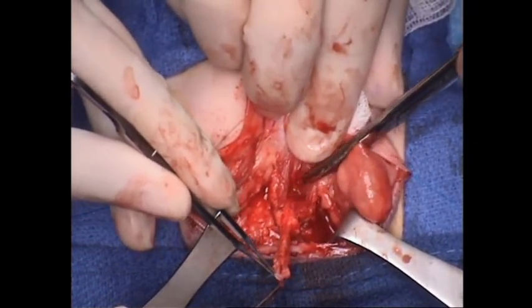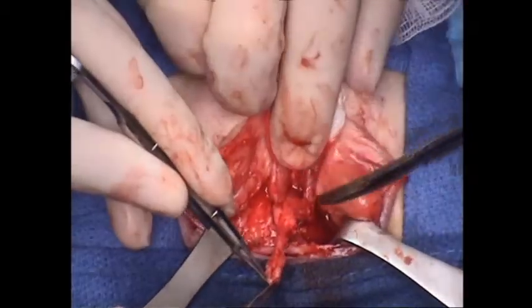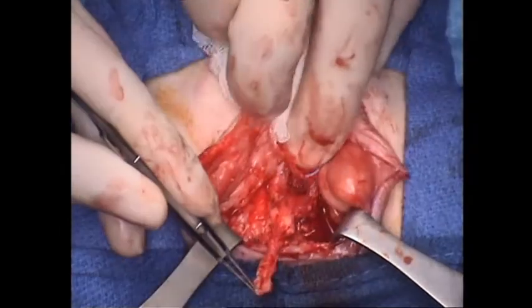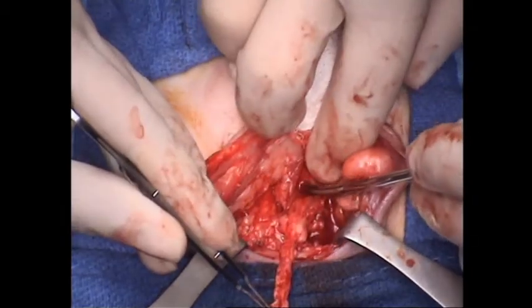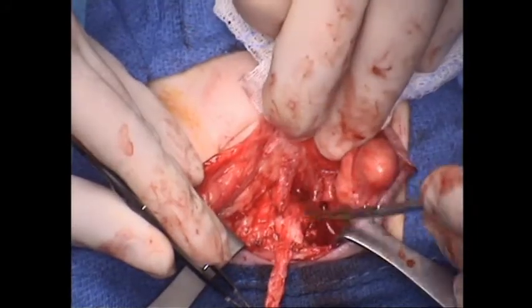And so we stop this dissection where the corpora are diverging, but once you start doing this dissection, you will see and feel how much length you're gaining by transecting these tethering tissues down here. And that feels like we're in really good shape. The urethra is about to turn through the external sphincter right here. So that's where we have dissected to, is right there.